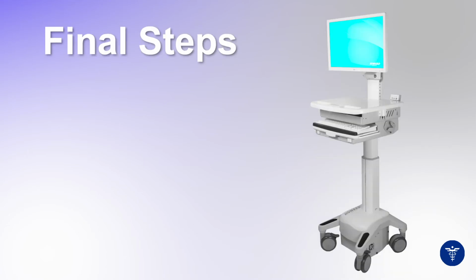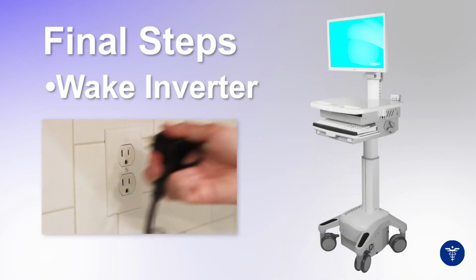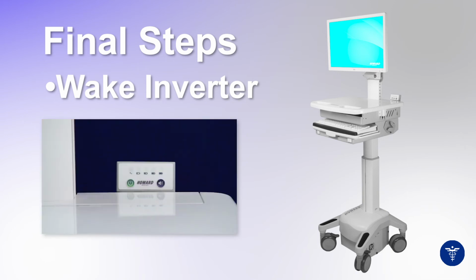The final step is to power the cart back on and wake up the inverter. To do this, you will need to unhook the power cord from the cart and plug it into the wall to wake up the inverter. You will know that the inverter is awake when all lights on the fuel gauge show green.